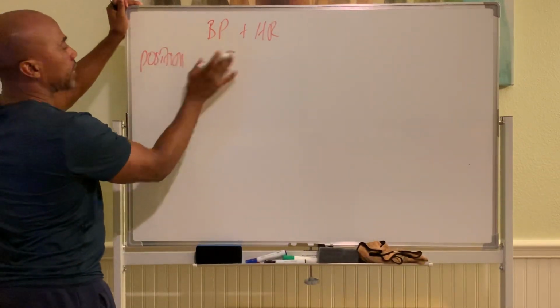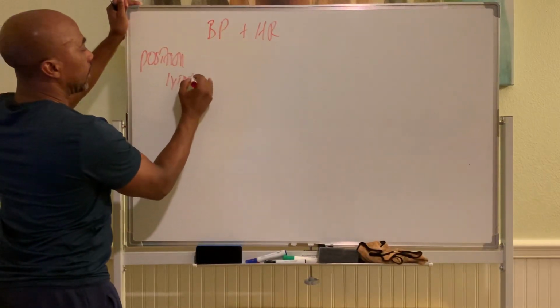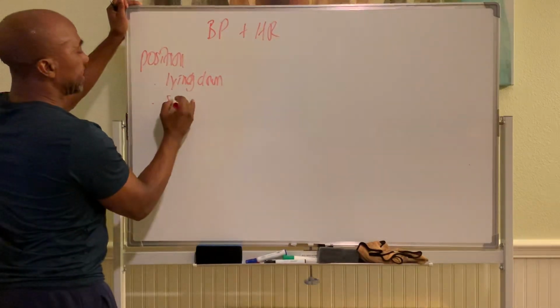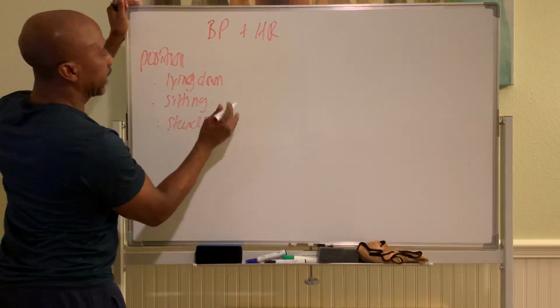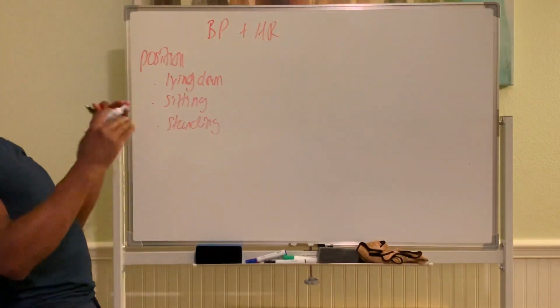Okay, so we're gonna assess for these when you are lying down, when you're sitting, and when you're standing.